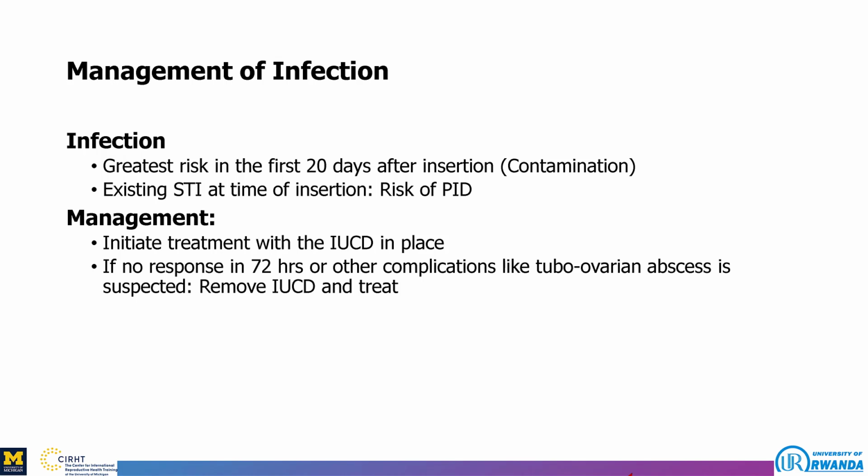If the woman experiences infection, we have to initiate treatment immediately with the intrauterine contraceptive in place. And if there is no response to the treatment within 72 hours, or other complications like tubo-ovarian abscess are suspected, then we have to remove the intrauterine contraceptive device and then treat.